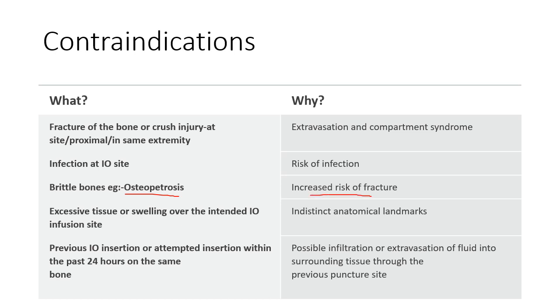Whereas for the rest, suppose the tibial site has a fracture or a crush injury, or you are suspecting that there is a disconnection between the bones due to whatever reason without even a proven fracture, then you should not do it. Why? If you are going to inject fluids, you are going to extravasate and cause compartment syndrome. If there is an infection, that's a no-brainer. You are not going to risk infection. So you will not do it at that site.